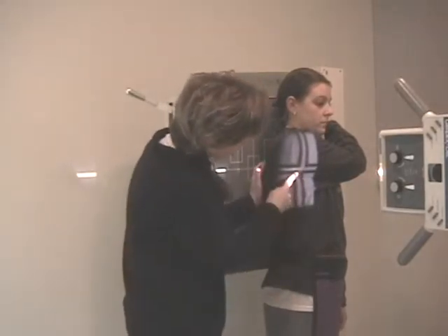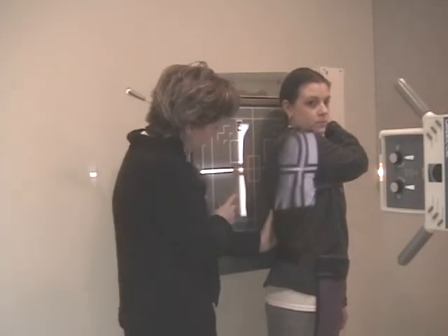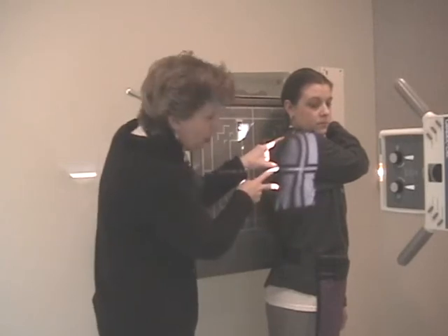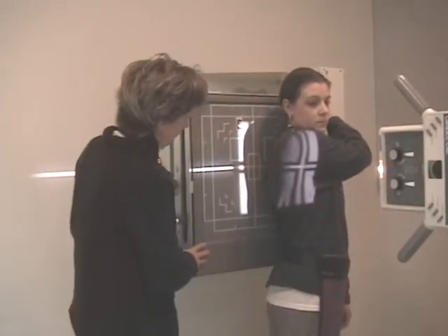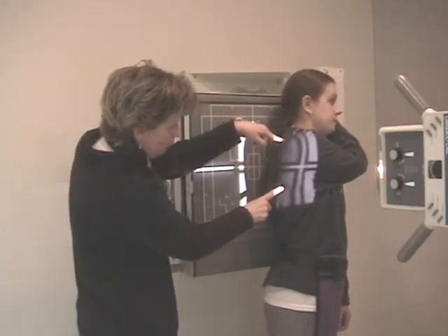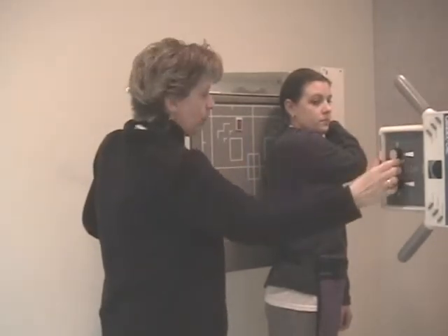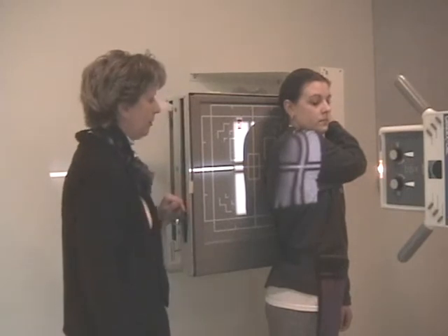The crosshair should come right down the bone. Have her baby-step away, and you can use your vertical board to see how much tissue is over the center of that wall bucky. Palpate for the superior border and the inferior border, and see how this crosshair is coming almost exactly right down the center — just a slight shift higher is needed. You can see the film's edge is two inches above her shoulder, but I'm being precise because I found the two borders and centered them exactly. The marker is just inside the collimated field. Notice that too wide a light field is too much — collimate down more, closer to the body, particularly if you're using automatic exposure control.